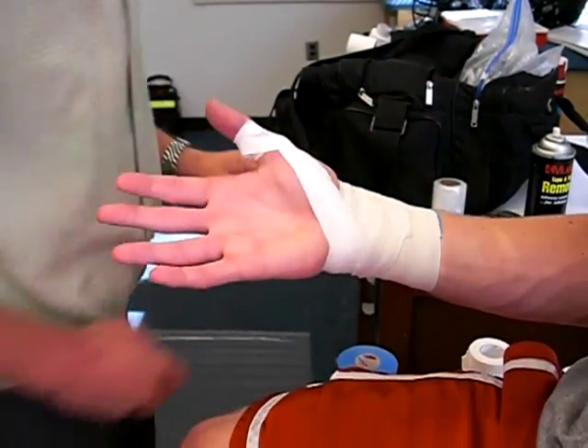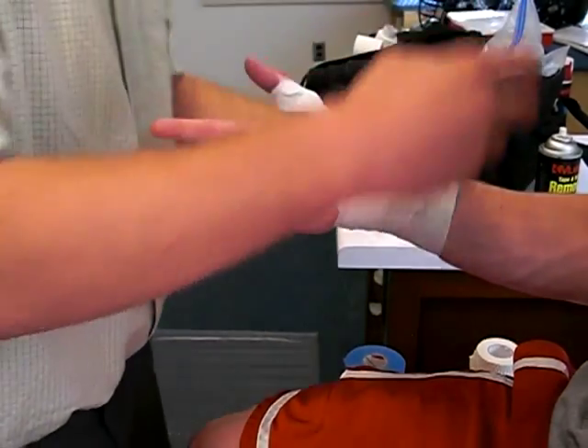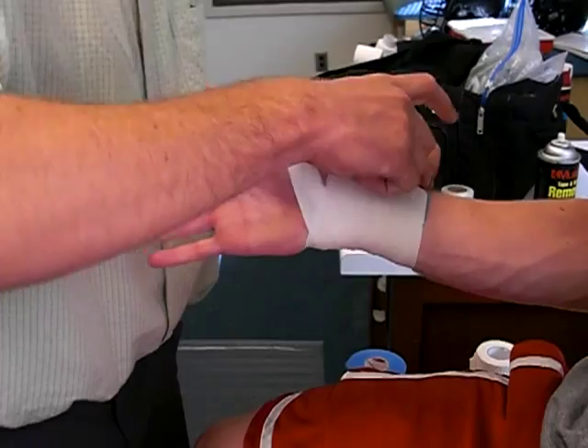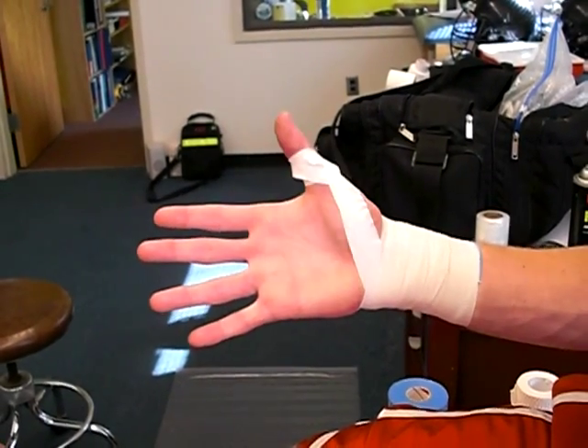After you get all that applied, slap on the cover so it stays. And that's going to restrict that thumb abduction. Very good.